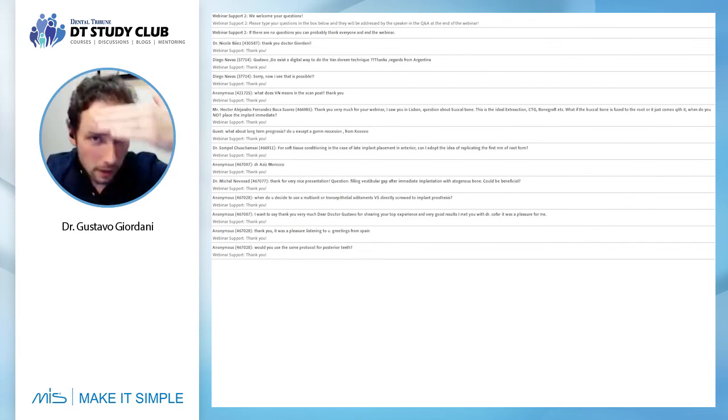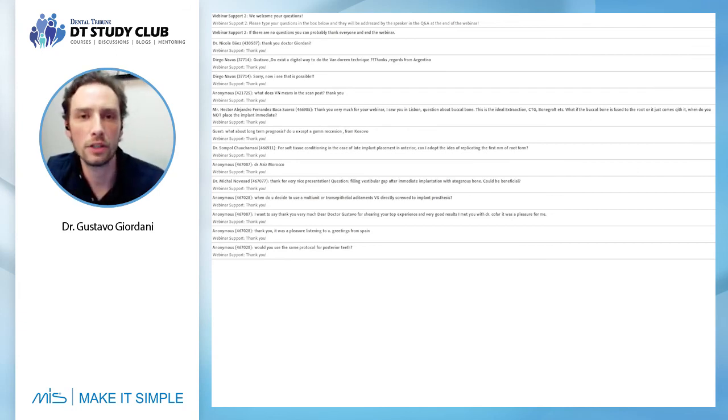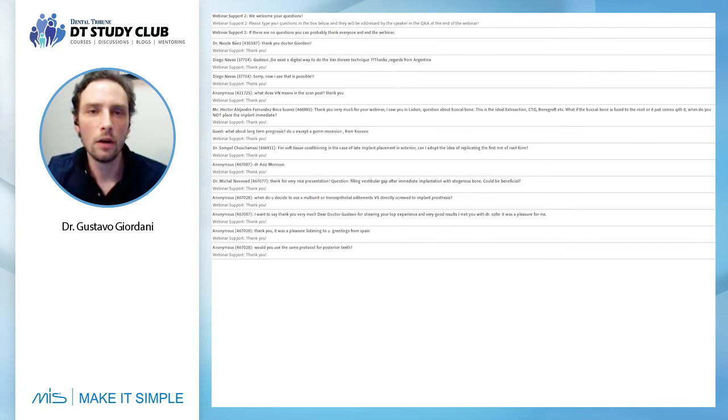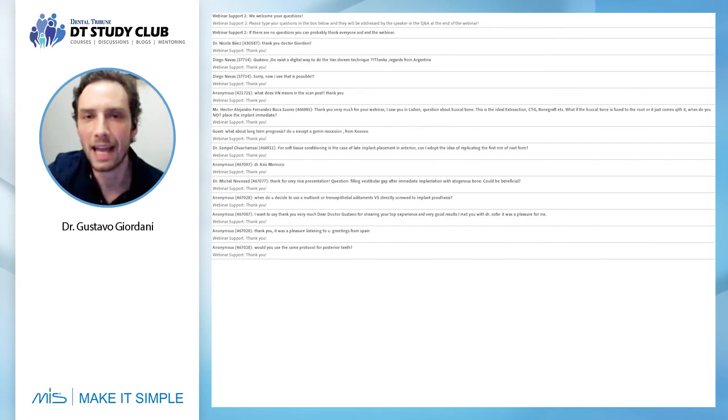If you lose the full buccal bone, you just do exactly the same protocol. And we pack biomaterial with some collagen inside. We try to use the Bio-Oss Collagen, and we just pack there because it's more stable. And if you lose all the buccal wall, maybe it's time to use a small membrane to keep everything in position. And then you do connective tissue graft, and you do exactly the same. But I use exactly the same protocol if I lose all the buccal bone.